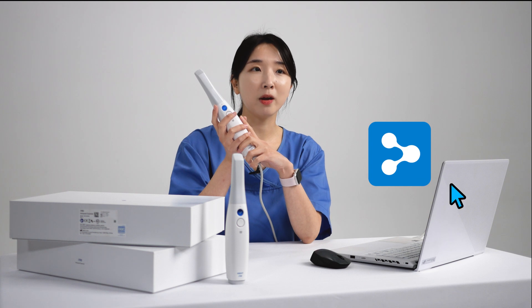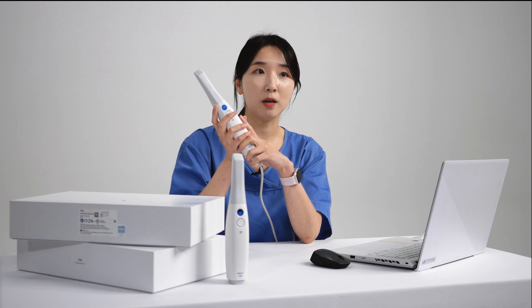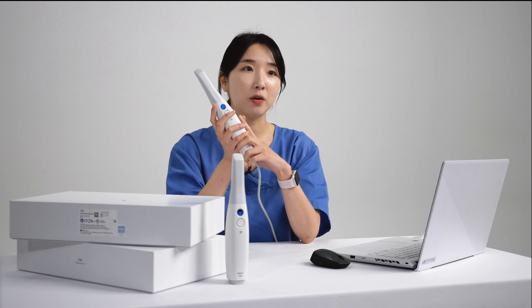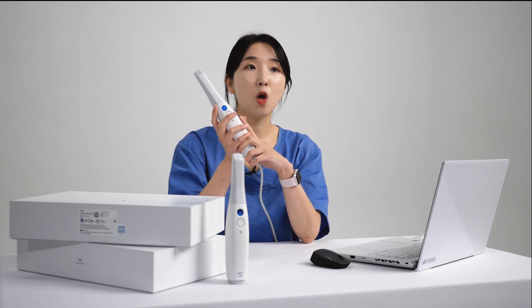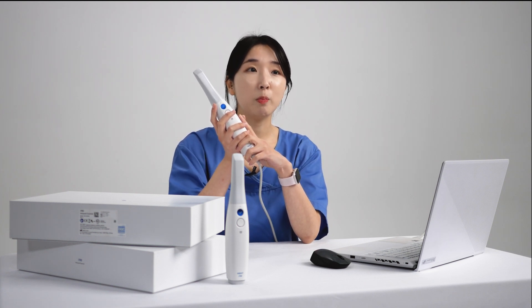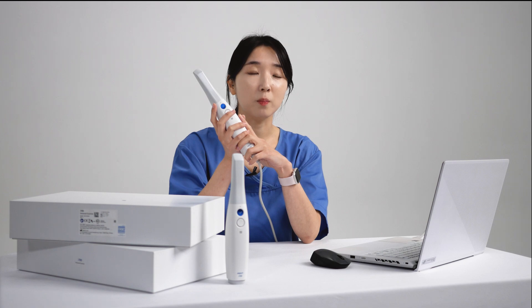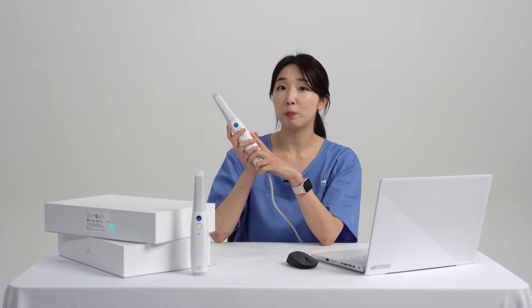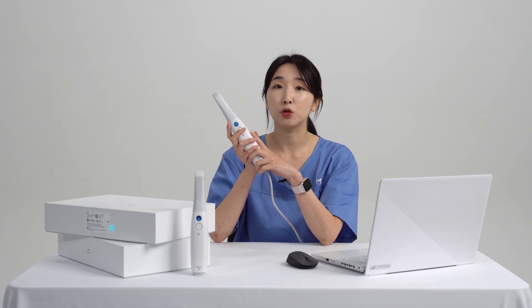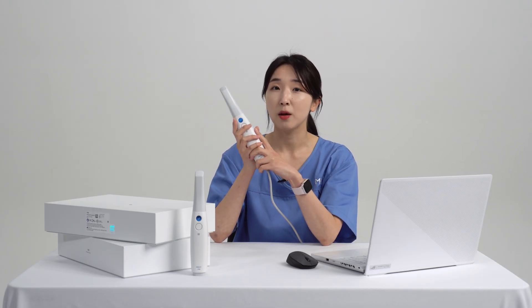We've created a MeditLink account to log in, connected to the scanner, and this is all we need to do to prepare for scanning. In the next episode we're going to go straight to scanning, so get ready!